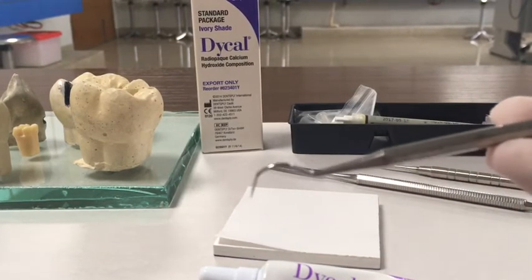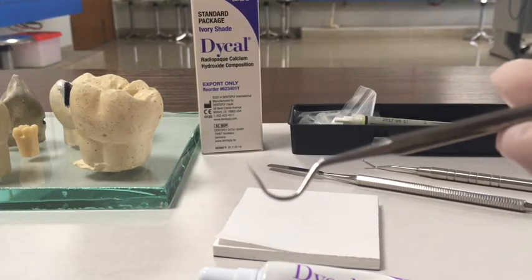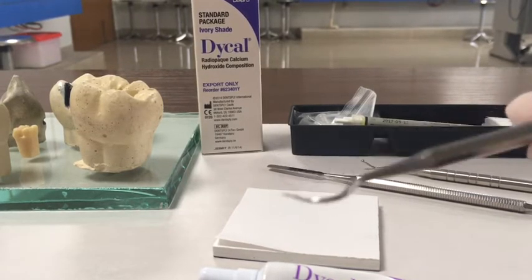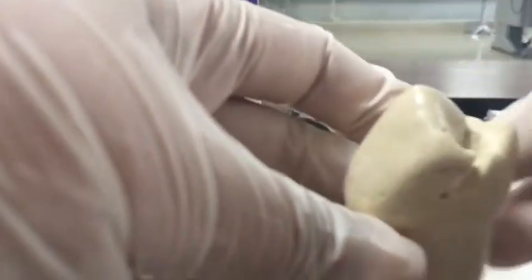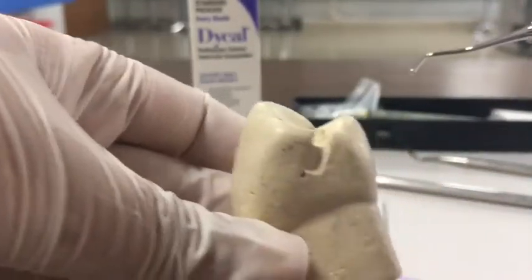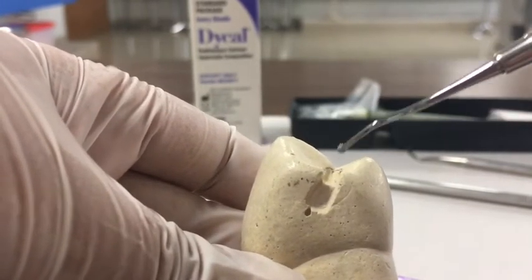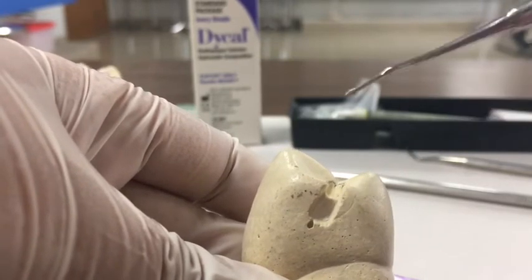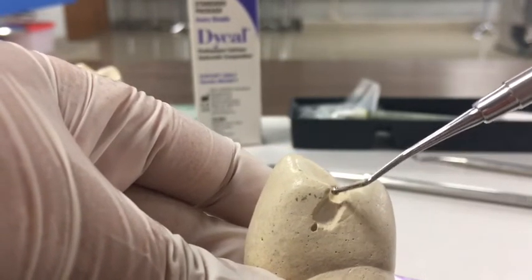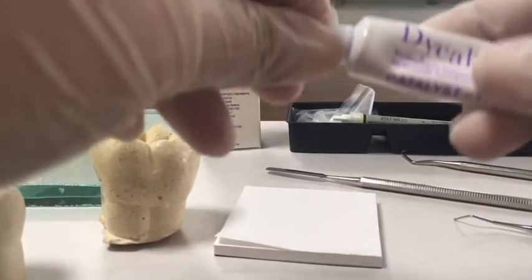Now this probe we are going to use for removing the excess cement that has been accidentally applied on the walls of the cavity preparation. Now, this is the proximal box of a typical class 2 restoration, and I'm going to show you how to apply calcium hydroxide cement on the axial wall. Now these other walls, the buccal, the lingual and the gingival floor, we are going to keep them free of any kind of calcium hydroxide cement.